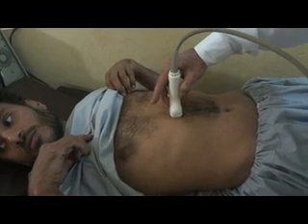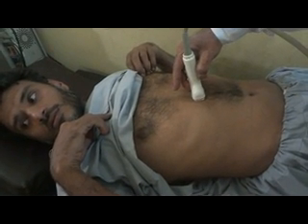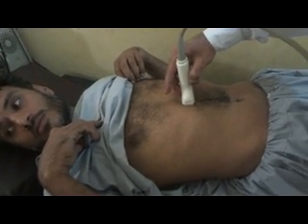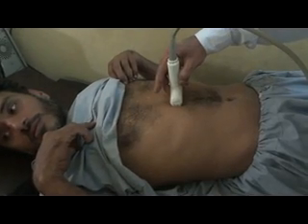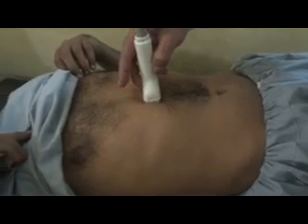Now, the landmark for identifying that you are really seeing the pancreas and not some other structure is the splenic vein. This is the splenic vein, and here is the superior mesenteric vein. Remember, this is very important because vessels are usually the most important landmarks for the identification of an organ.